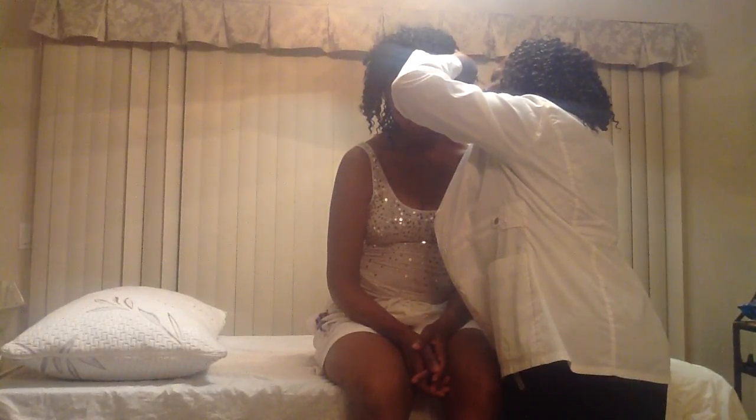So now I'm going to use my stethoscope. I'm sorry, my otoscope, and I'm going to be looking inside your ear. All right, so by looking in the ear, I see the auditory canal is lightly pink, no lesions, no redness, no bumps. Okay, the hair inside your ear is evenly distributed. Okay, I'll do the other ear.